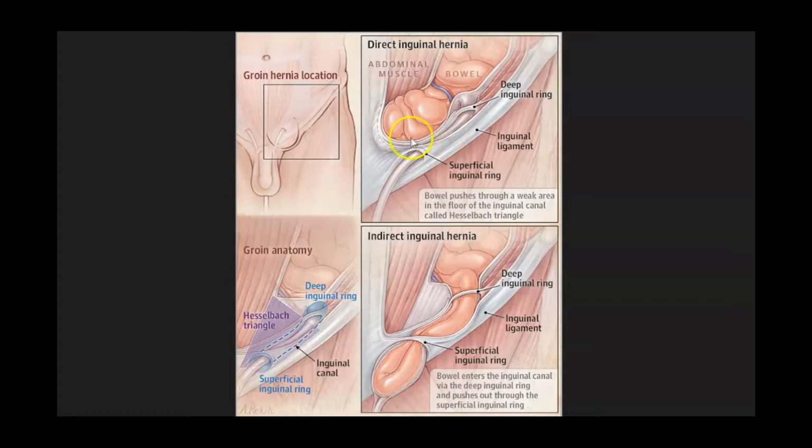And now if the patient says that the mass is not always present, you have them do Valsalva. You could also have them stand upright and scan them upright if the bulge comes out while they stand, using gravity as the force to create the hernia. Now the hernia may contain bowel or it may contain just mesenteric fat, so keep that in mind.